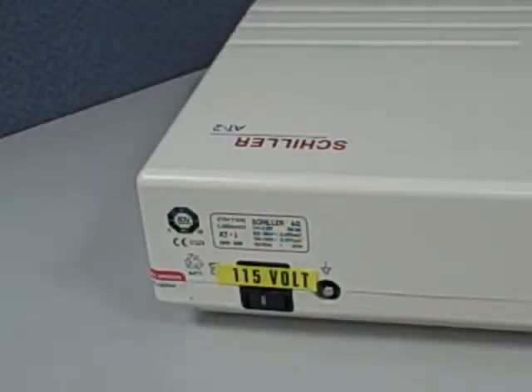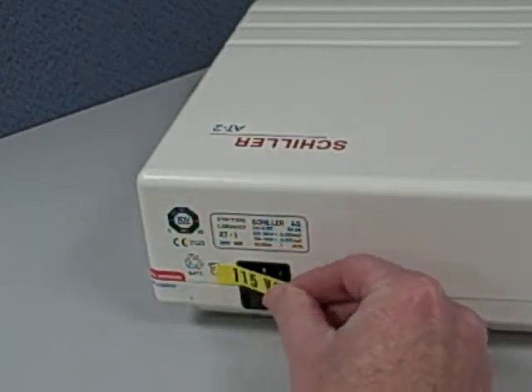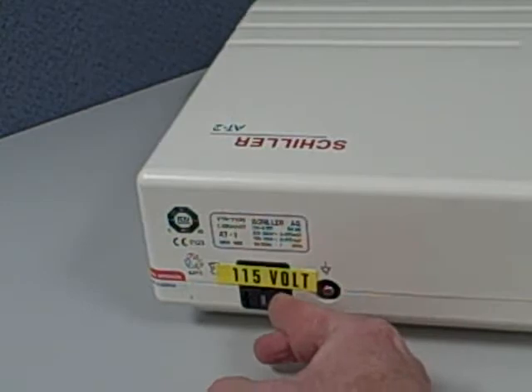The AT2 comes equipped as a 115 volt machine but can be converted to 220 by switching out a fuse and acquiring a 220 volt fuse for international use.